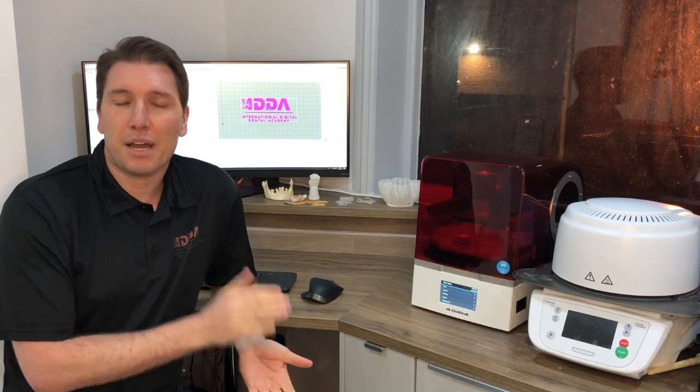Hi, my name is Adam Nolte and I'm going to give you my thoughts today on this little beauty, which is the Asiga Max UV. I received this about six months ago now, so I've been throwing everything I have at it.